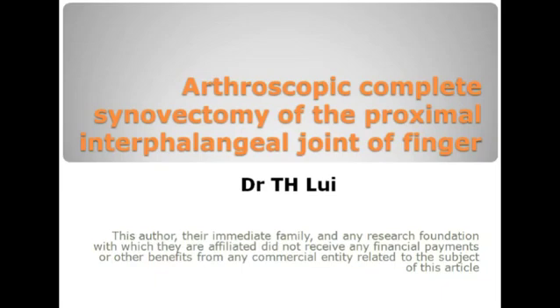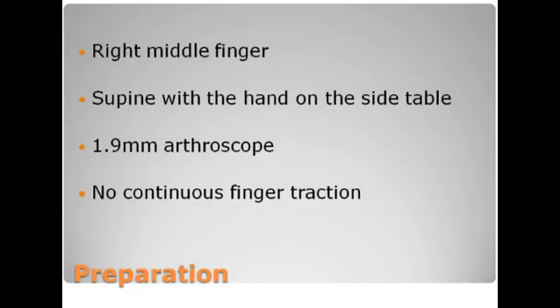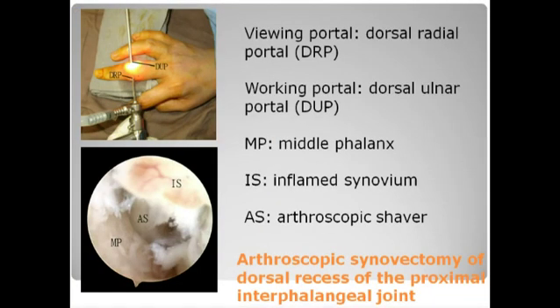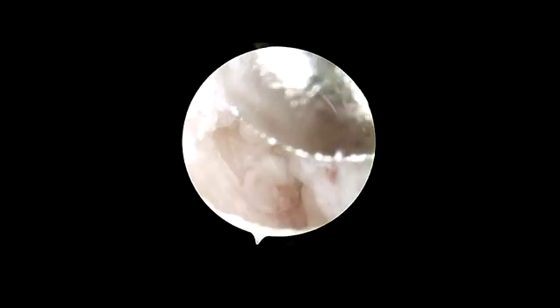Arthroscopic complete synovectomy of the proximal interphalangeal joint of the finger. This is performed through the dorsal ulnar, dorsal radial, and the volar radial portals.